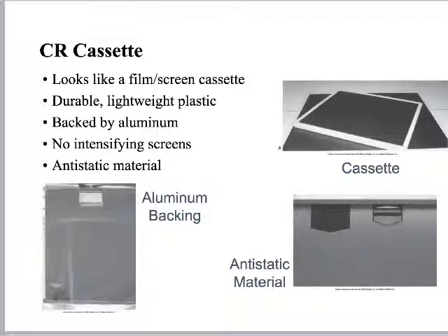Normally they're made out of a durable, lightweight plastic versus the old film screen things. They were pretty heavy duty. In fact, they had lead backing in them, so you would not want to be hitting the head with an old school film screen cassette. A lot of ours are backed with aluminum. There's not an intensifying screen inside of it.